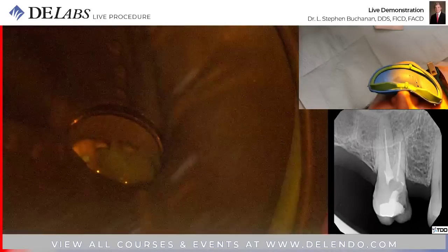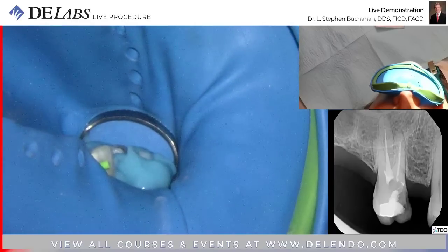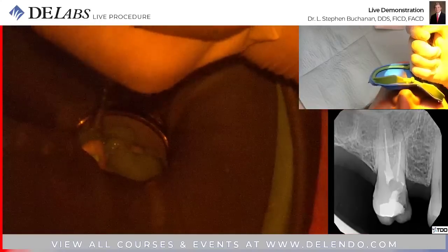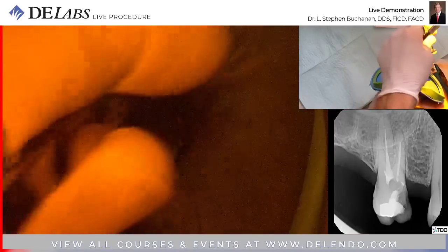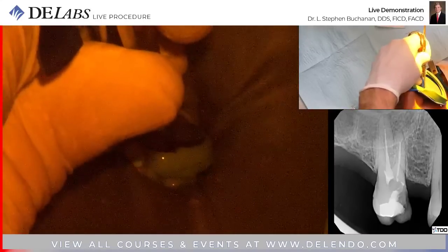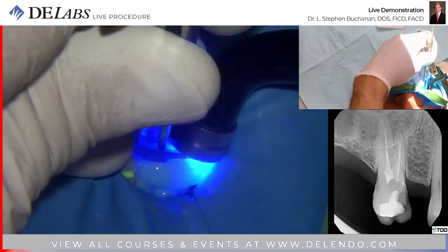Oh, I can't put the light on it or it'll set up. The sponge stays in there? No. It's just to keep this junk from getting in there.